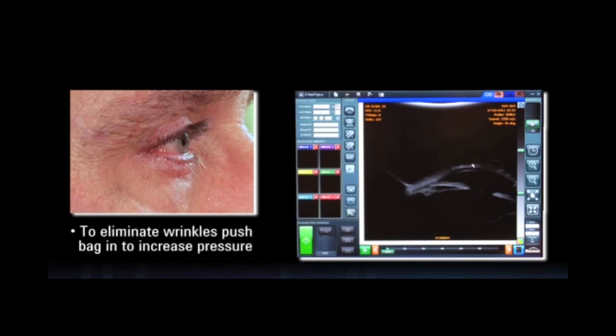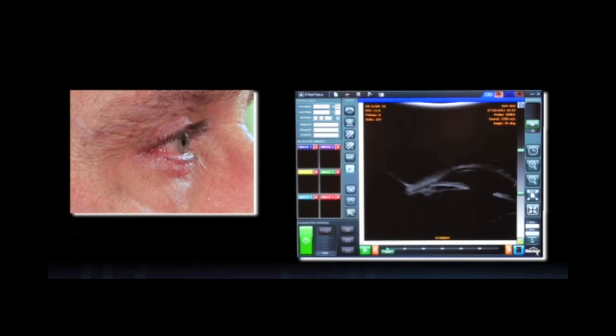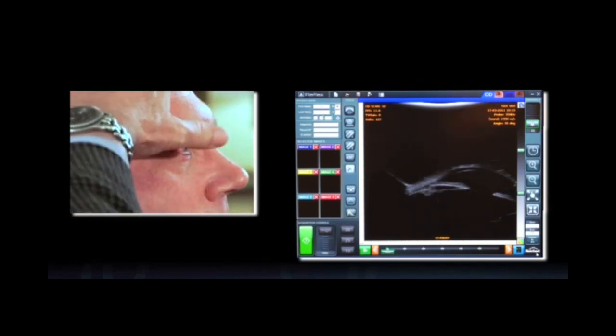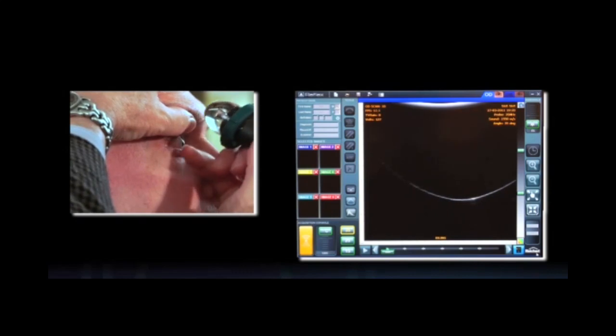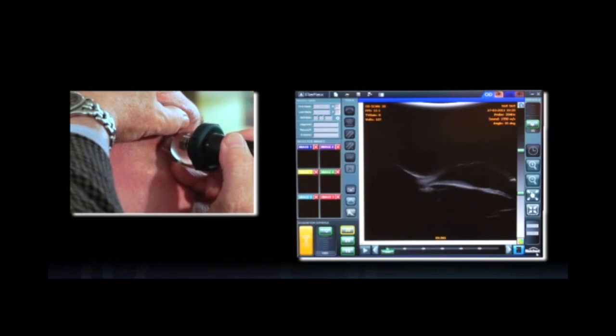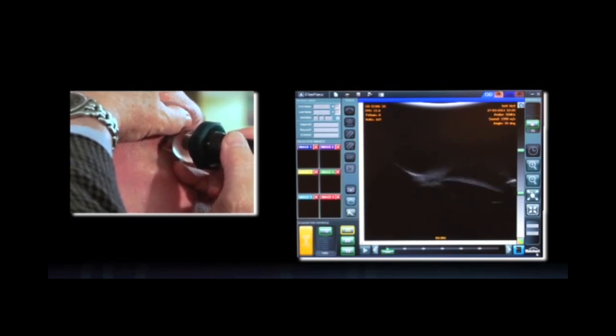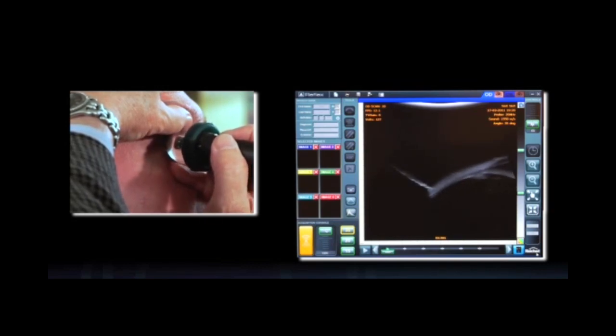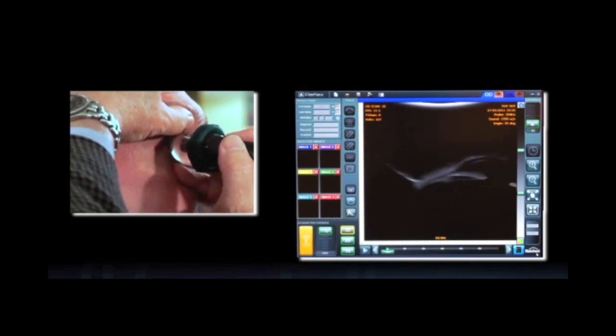Now, to eliminate those, you just push the probe in slightly into the bag to increase pressures. I want to do this one more time. I want to show you how to identify the angle, whether it's open or closed. That didn't hurt, did it? Oh, a little cool. Like a cool balloon. I'm pushing down. I can go way on the side of the eye. That's the big advantage here for looking for pathologies on the side of the eye.